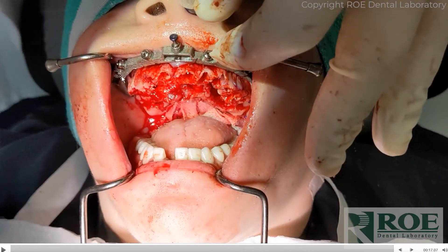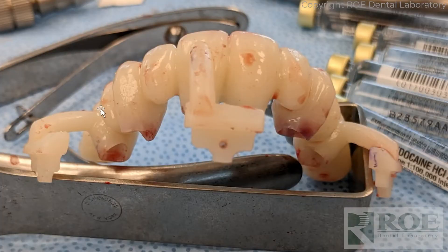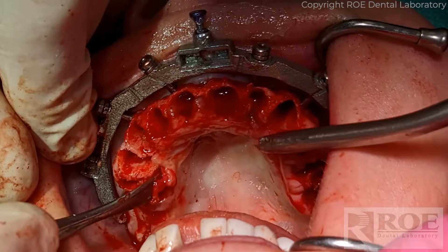The conversation is: should this bone be reduced because it's so much lower than the other? Some will be reduced, but you want to create a little scalloping — a lot of this just disappears over time through biology. The goal is to save bone, so you make decisions during surgery about whether it's the bone or the prosthetic. If the prosthetic was made very thin, bone has to be reduced — if you end up with a prosthetic less than 10 millimeters, you'll have to open the bite later to make room for material. In this case there was a choice because the prosthetic is quite tall, especially on 6, 8, 9, and 11, so we ended up reducing both the prosthetic and the bone.